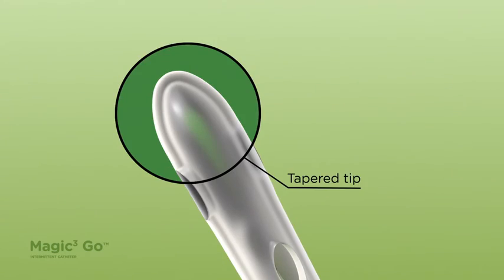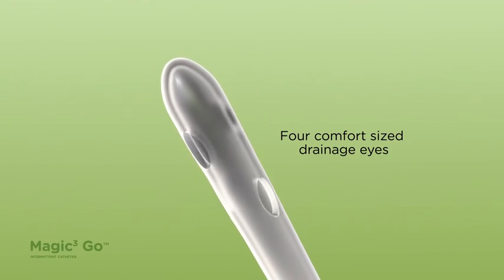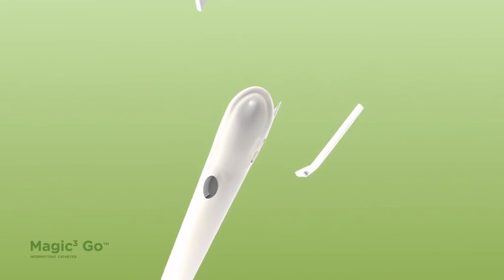The catheter tip is tapered and has four drainage eyes for ease of movement over sensitive areas. Urine flows into the catheter tip through the four drainage eyes.